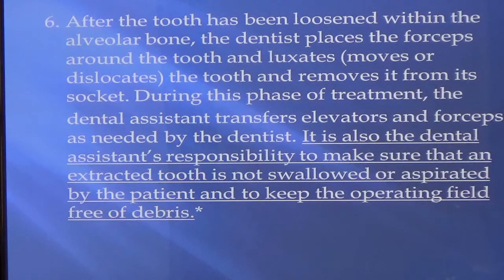But should anything fall, a piece of filling, again, remember the patient is laying back, a piece of filling, the tooth break, or crown break off or something, you've got to be there with the suction, ready to suction that out. Normally we'll put what's called a throat pack, which is just a drape behind it, but even so, you have to be ready to catch anything that falls off.